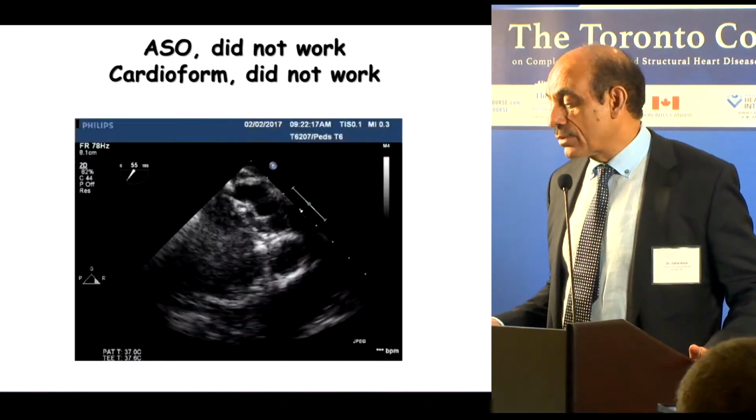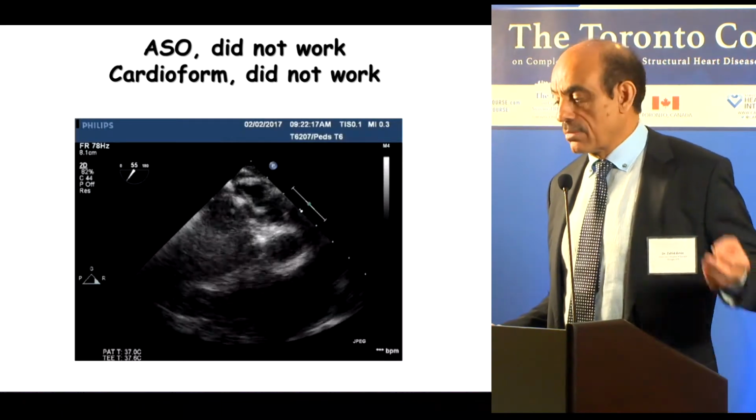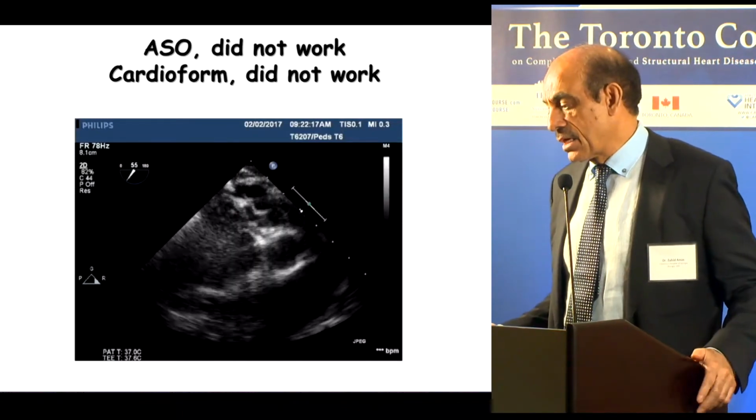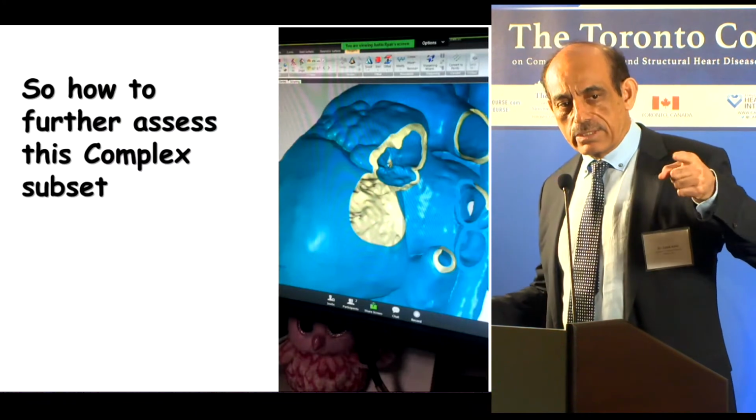And so we went in with the Amplatzer device. And this device, again, after we waited for about 5 or 6 minutes, popped out very, very easily. So it was very confusing for me what you did. So could you run this faster with me, as I told you?